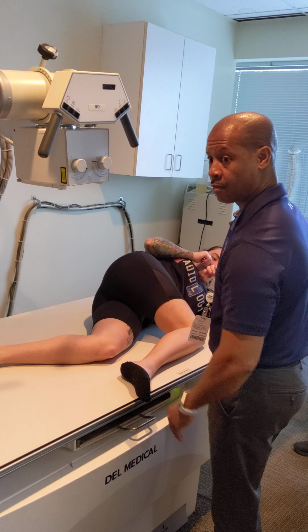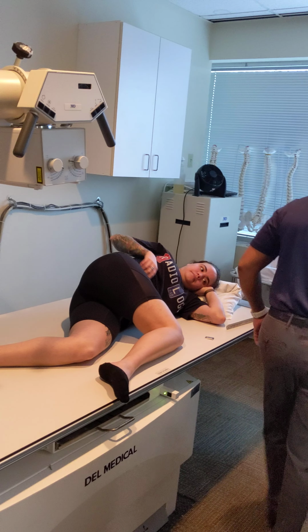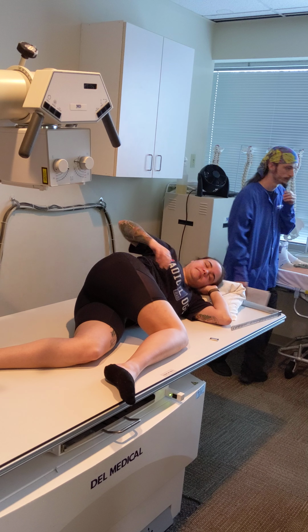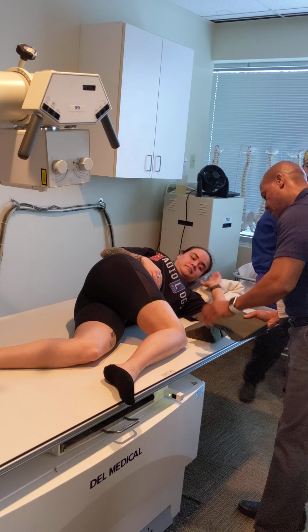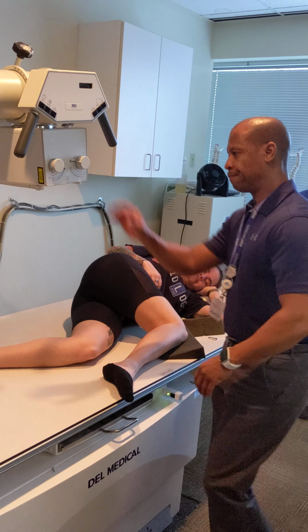So what did you just say, just roll over onto your side? Roll to your side. Okay. Now at this point, excuse me, sir. Let's put a little something right here to give you a little comfort. How's that, ma'am? Wonderful.